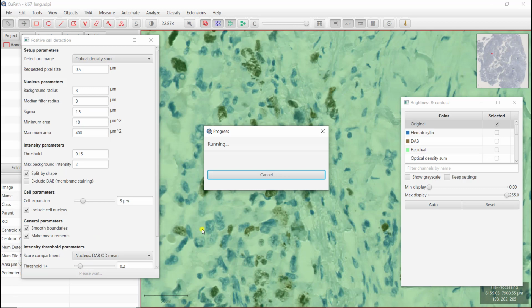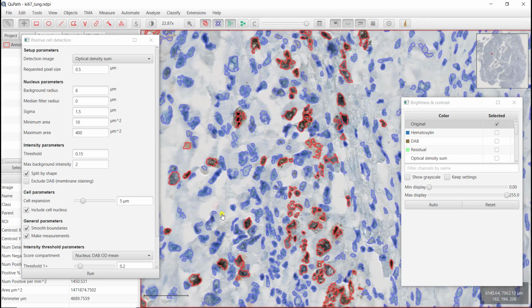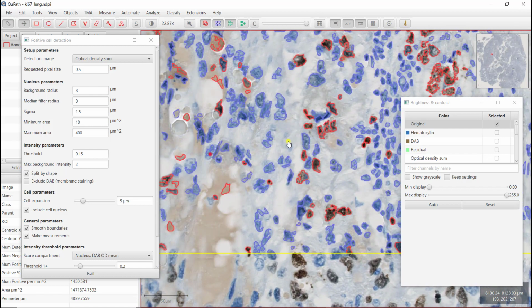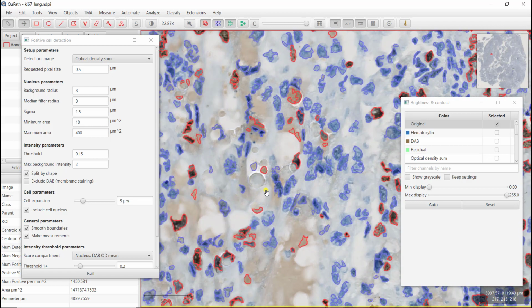Now with watershed, you will never get something perfect. It's always a trade-off between different parameters. So it's easier to move only one parameter at a time, because here we have quite some parameters to understand what we're doing. And sometimes it's going to work, but sometimes it's not going to work. And that's really a trade-off between those kind of things.